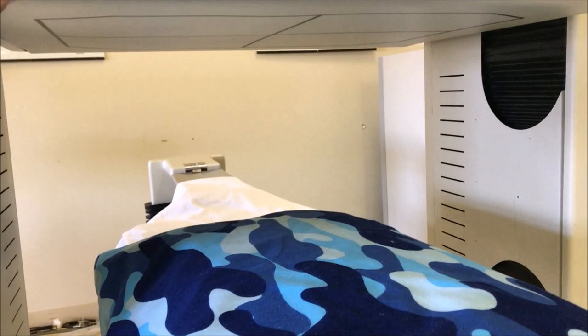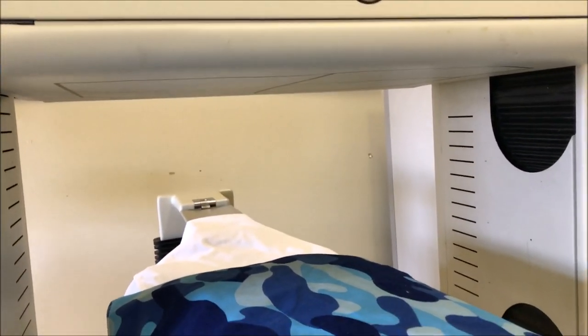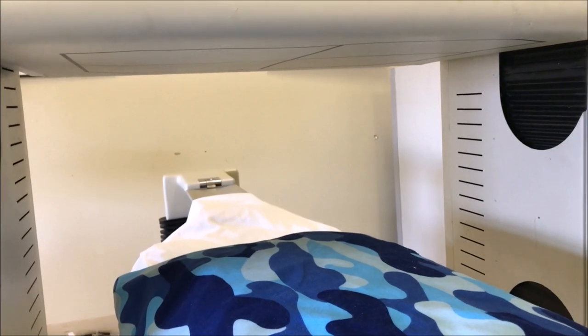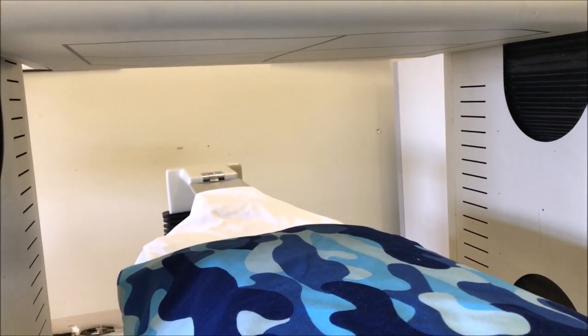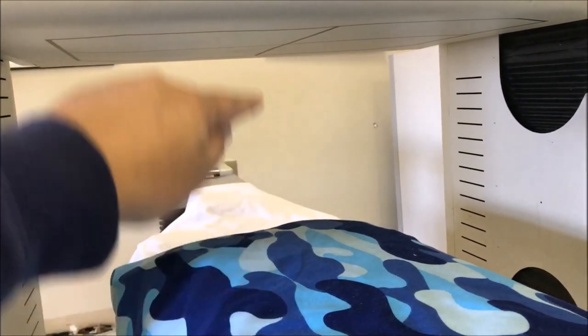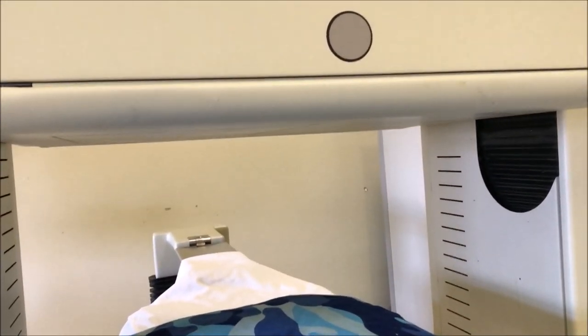So this collimator is called a physical discriminator and its job is to ensure — or try to ensure — that we eliminate photons that come at the wrong angle. From the patient's point of view, everything coming out of the patient in a planar way, we want photons coming out perpendicular to the camera. Photons coming out at an angle are removed from the image using this physical discriminator.